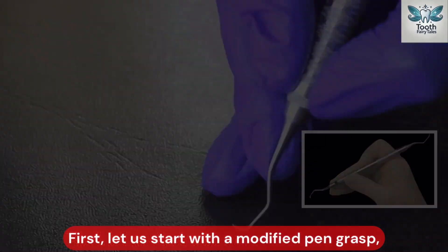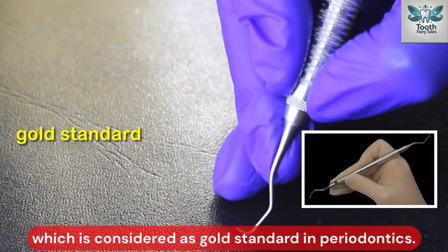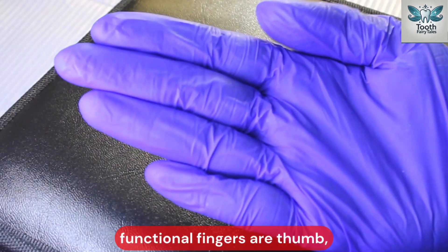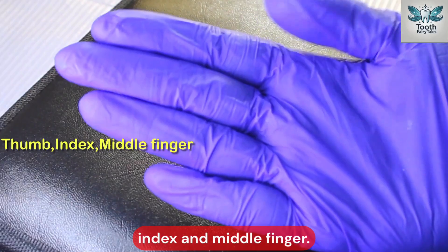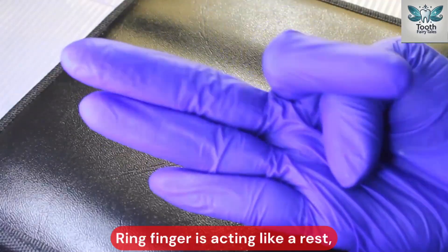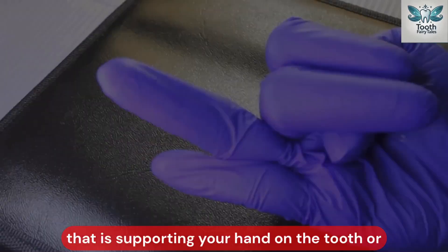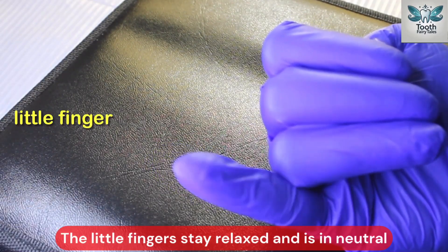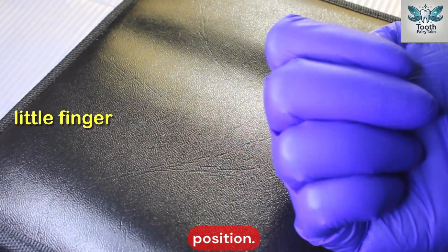First, let us start with a modified pen grasp, which is considered the gold standard in periodontics. The functional fingers are thumb, index, and middle finger. The ring finger acts as a rest, supporting your hand on the tooth or oral structure. The little finger stays relaxed and is in a neutral position.